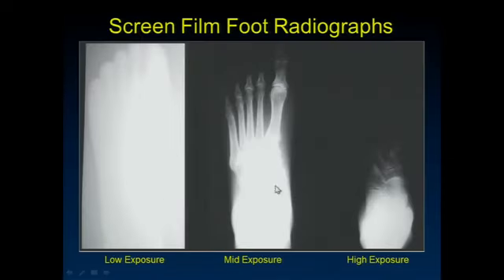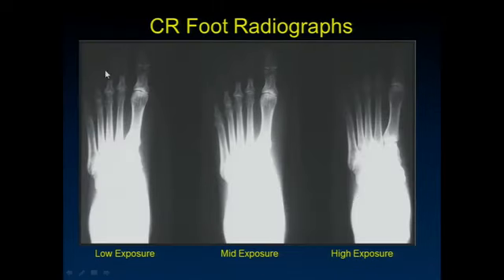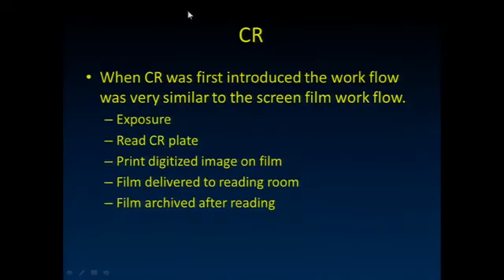So here are screen film foot radiographs: low exposure, mid exposure, high exposure. One of the big benefits of CR is, like we said, that more uniform response, really that linear response across a wide range of exposures. When CR was first introduced to the workflow, it was very similar to the screen film workflow.